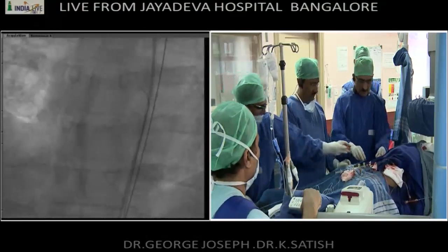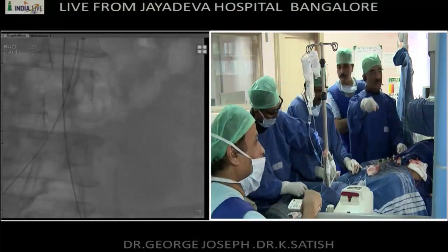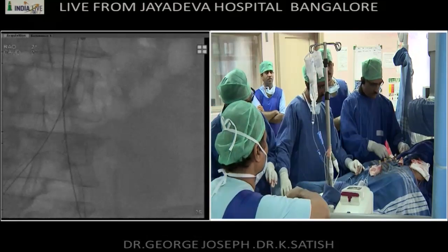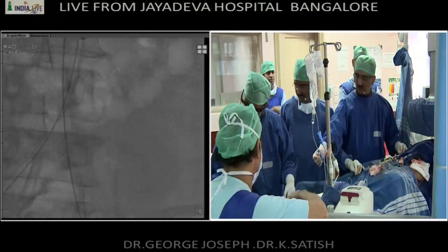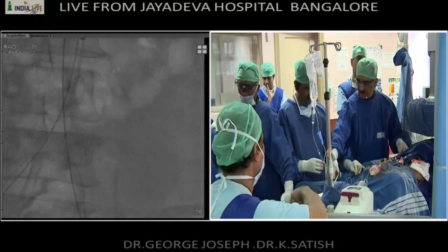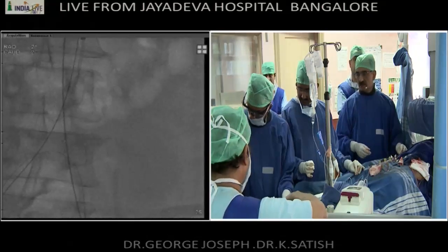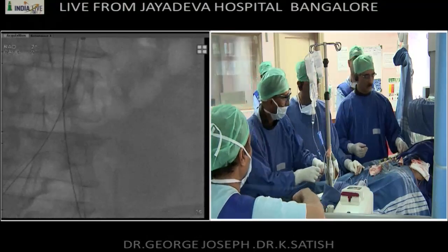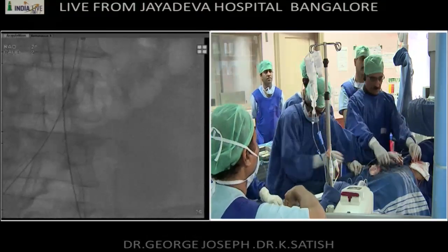Both are very good. So now before we remove this Astato, we must put a catheter on it over the aortic bifurcation. Otherwise, if I just pull the Astato, I could cut through the bifurcation. So any catheter, 4F, 5F, a small catheter on the hard end side of it. Hard end is there. After that, it's regular, we stent both sides, and we should be done after that.